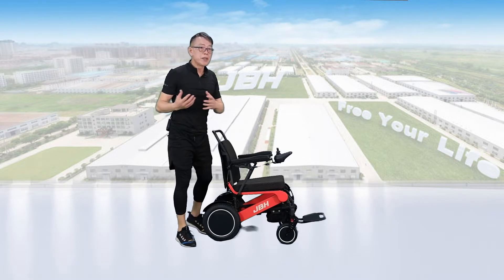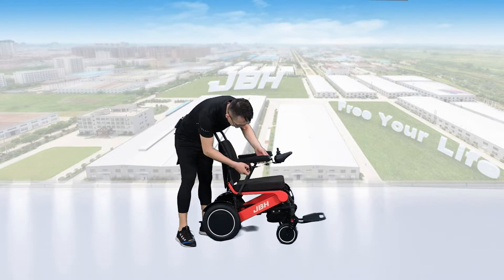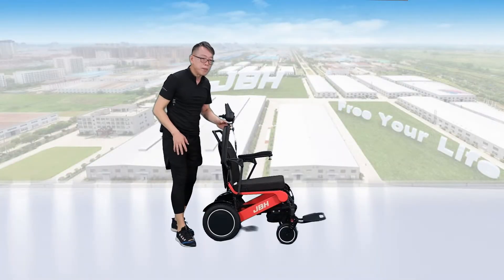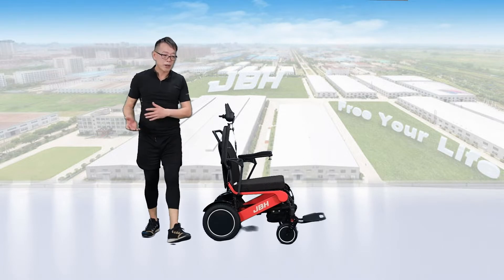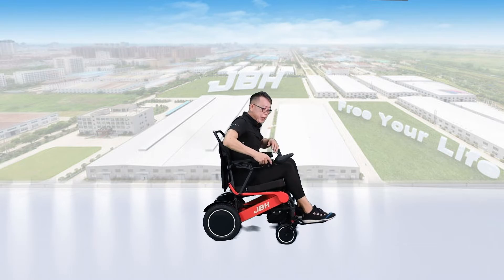You can access the wheelchair either from the side or from the front. If you want to access from the side, just lift the lever up so you can flip up the armrest, allowing you to access from the side. Then put the armrest back.